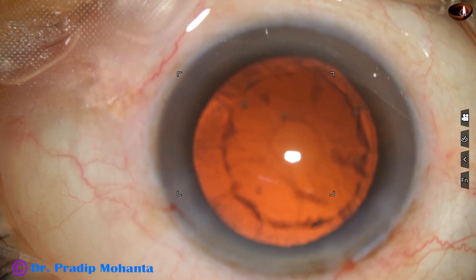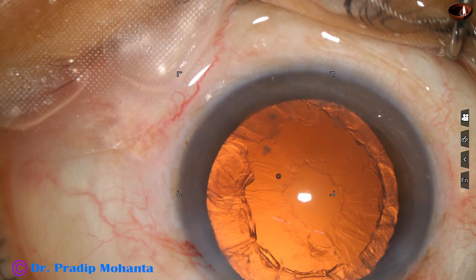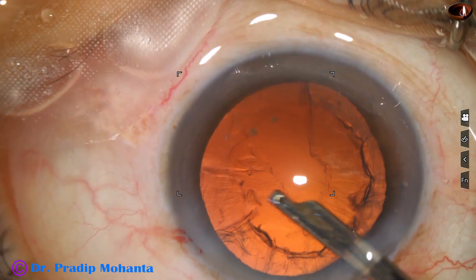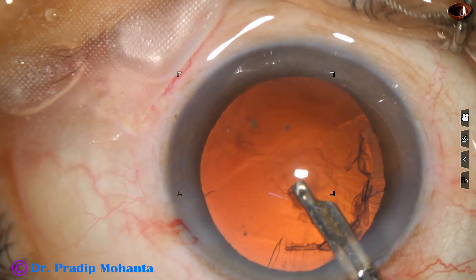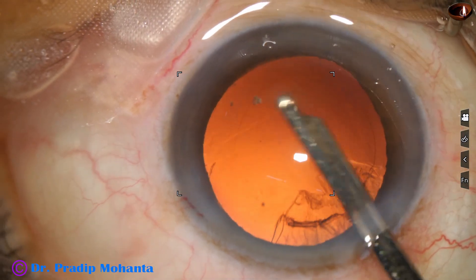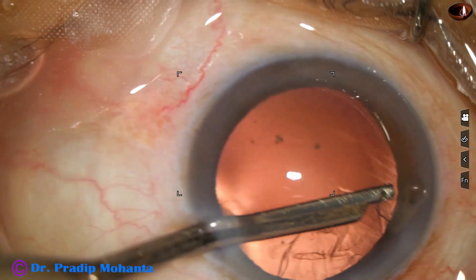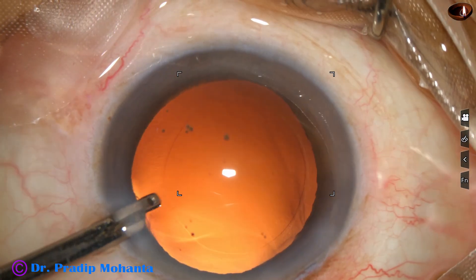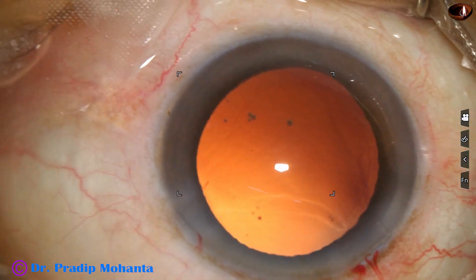And now cortical cleanup is to be done. I inject some viscoelastic. I have only one side port, and the width of the side port is a little more — about 1.7 millimeters. This is a 23-gauge Simcoe, and it easily goes through the side port. We can remove the sub-incisional cortex very easily going through the side port. If the side port is very small, we can use bimanual irrigation-aspiration for the sub-incisional cortex.